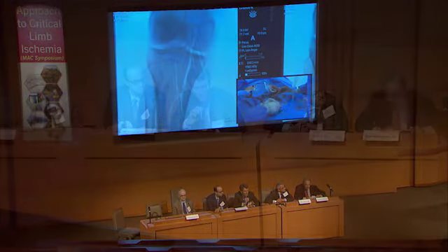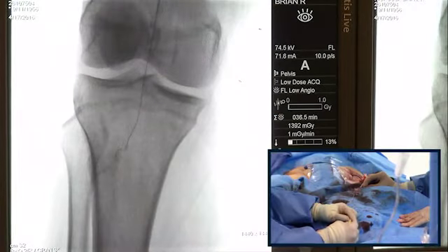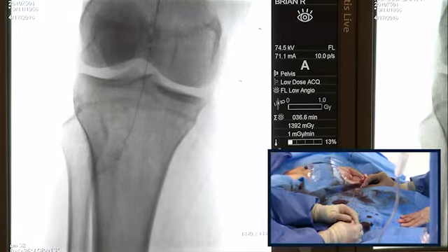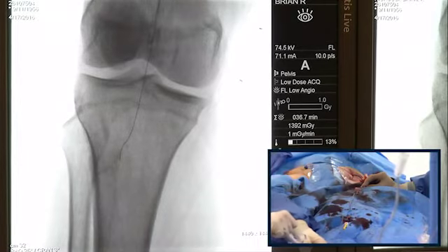What do you think? Oh, he moved, so his leg moved. So give me another, let me see. Now, by the way, I have very little control of the wire here, as you can imagine. Yeah. But it's very tight. I don't want to damage. Yeah, well, let me take another picture here.